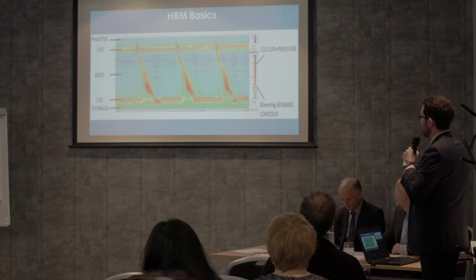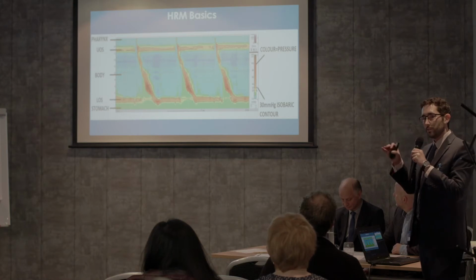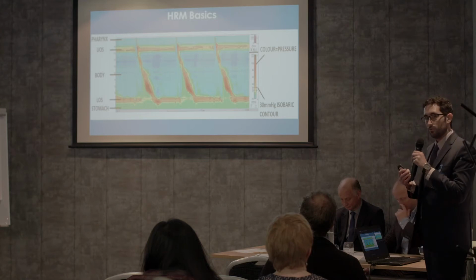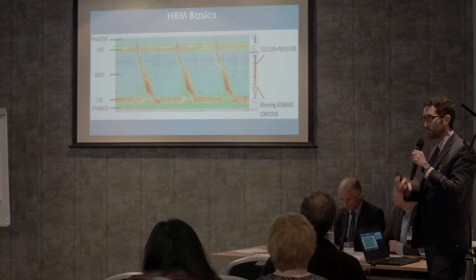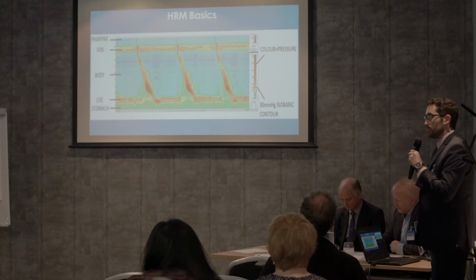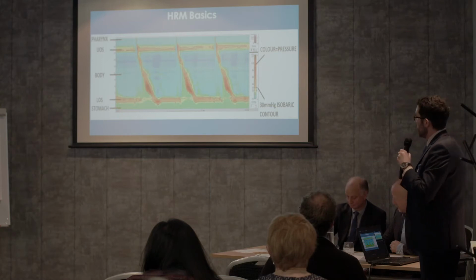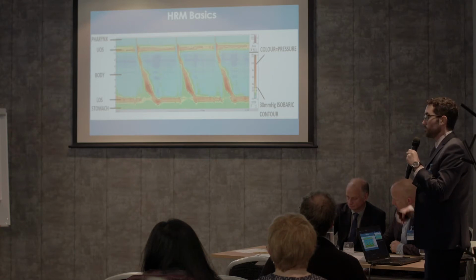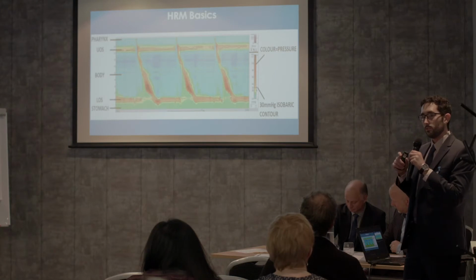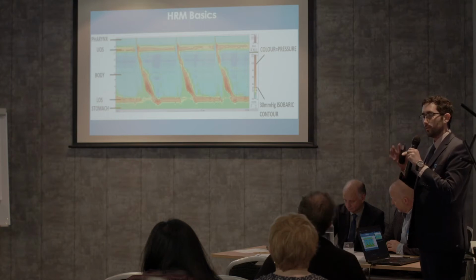But I think what is useful is if you can set the isobaric contour. This is the black line that you see surrounding the peristaltic wave. And that contour, just like a geographical map, will surround any pressure greater than what you've set on that scale. And this will give you a good idea of weakness of the contraction. It'll also give you an idea of any peristaltic breaks, so fragmented peristalsis. And you can also get a look at any compressions, or if there's resistance, or sometimes compartmentalized pressurization, so from a hiatus hernia. And that doesn't really matter how you set the pressure range then, because that will always have you covered.